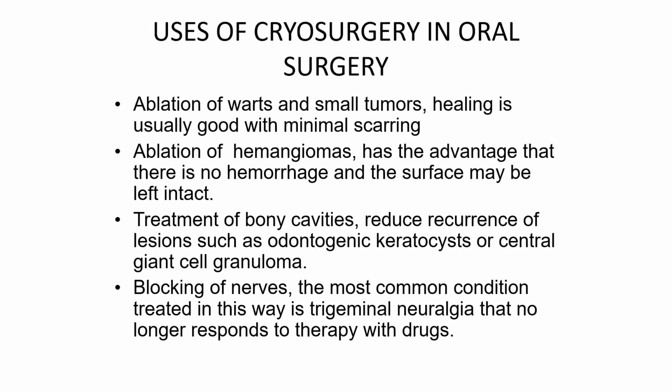Healing is good with minimal scarring. Ablation of hemangiomas has the advantage that there is no hemorrhage and the surface may be left intact. Treatment of bony cavities: reduce recurrence of lesions such as odontogenic keratocyst or central giant cell granuloma.